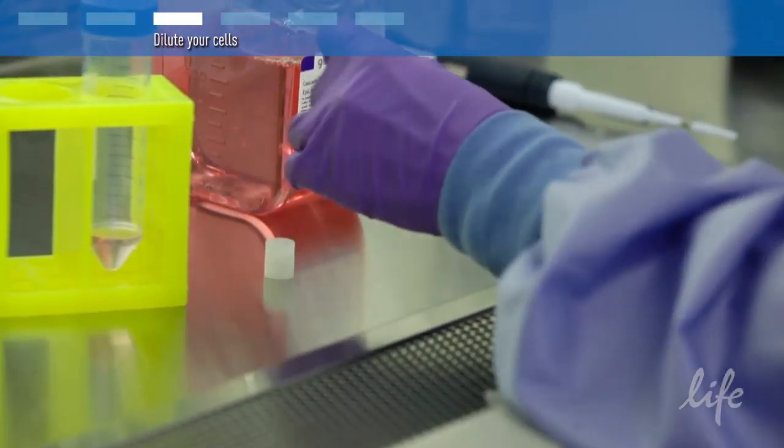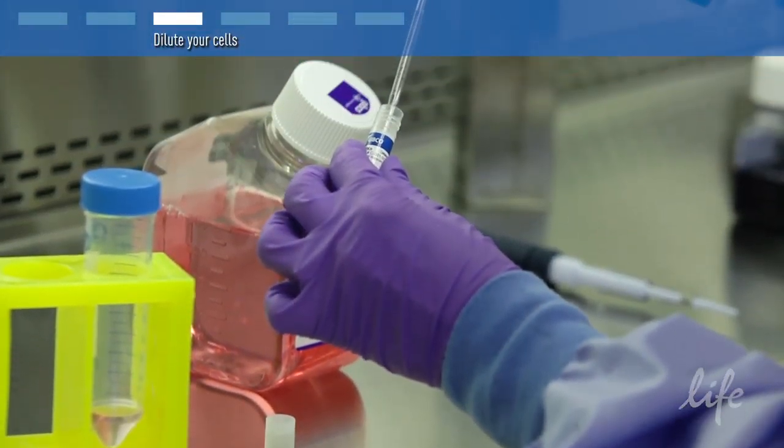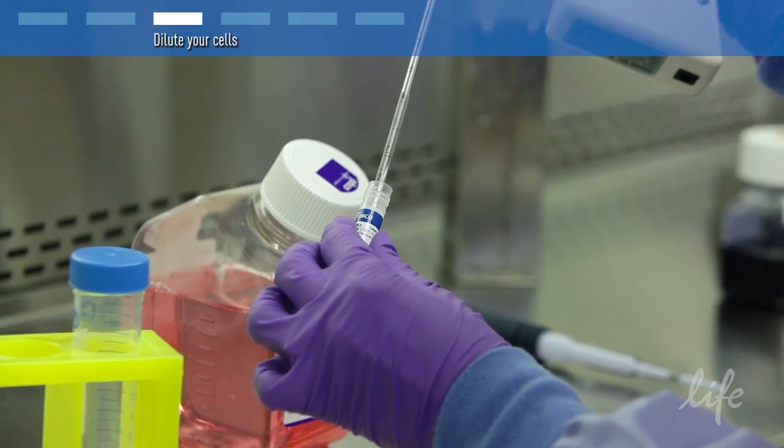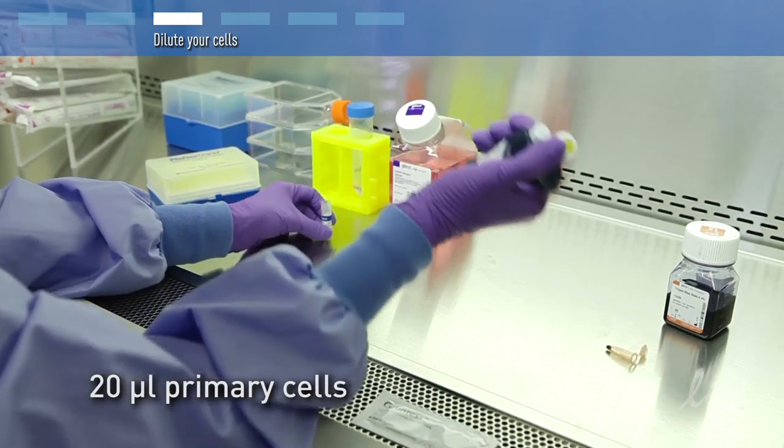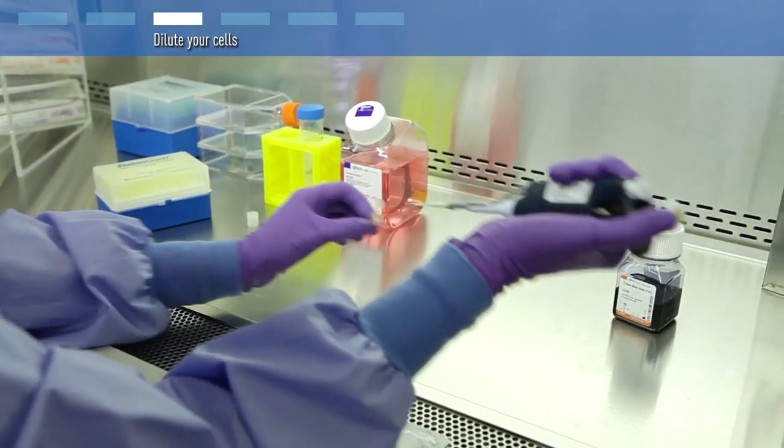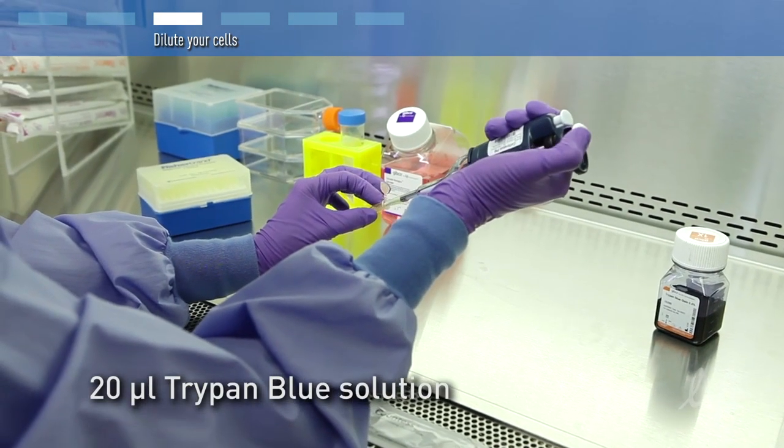Gently pipette the thawed cell suspension up and down to mix using a 1 ml pipette. Remove 20 microliters from the vial and add this to a separate tube that contains 20 microliters of Trypan Blue solution.